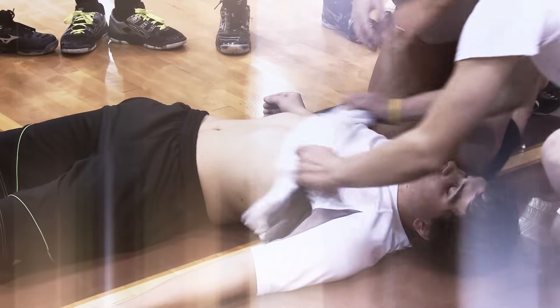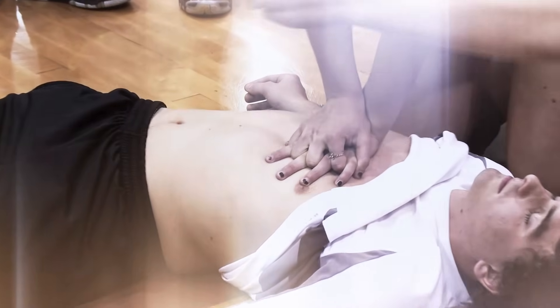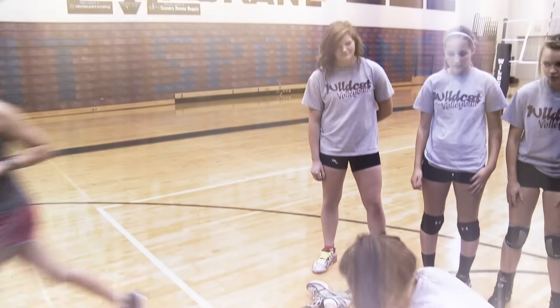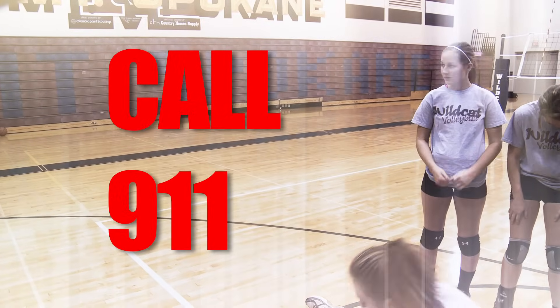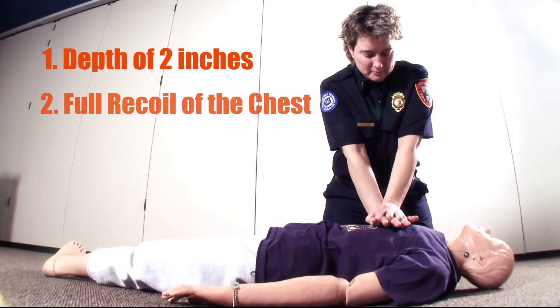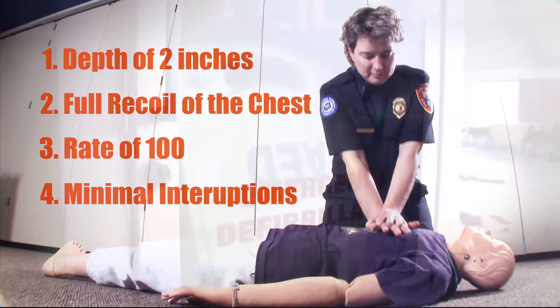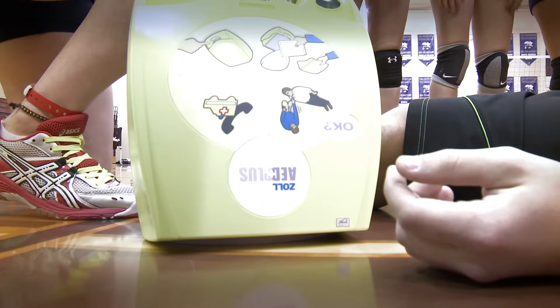Yesterday we discussed the recognition of cardiac arrest and why early CPR and activation of the emergency response system is critical for survival. Remember to call 911 early or direct someone else to do so. Recall the four components of high-quality CPR: depth, recoil, rate, and minimal interruption. All of these increase the likelihood of a victim to receive and respond well to electrical defibrillation.